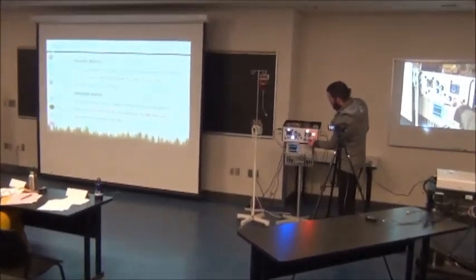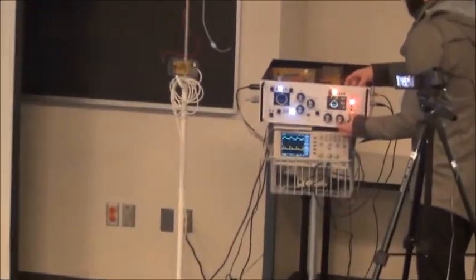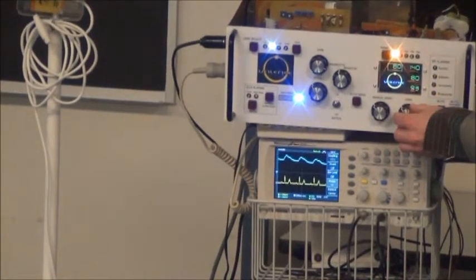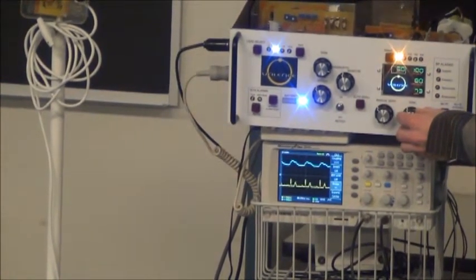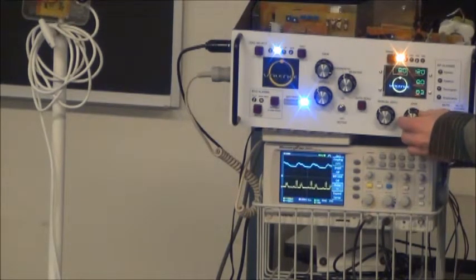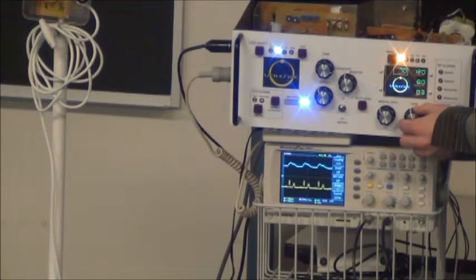When the pressure value reaches close to the alarm range, it will give a warning. Then when it goes beyond the range, it will continuously give an audible sound and LED display. The beep sound is shown when the pressure value is close to the range. Same in the case of diastolic also. You can see that in the diastolic.